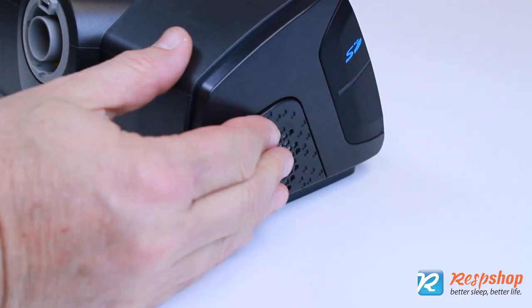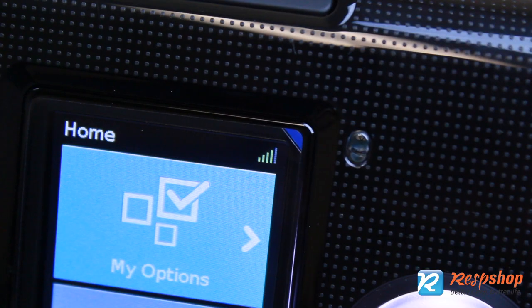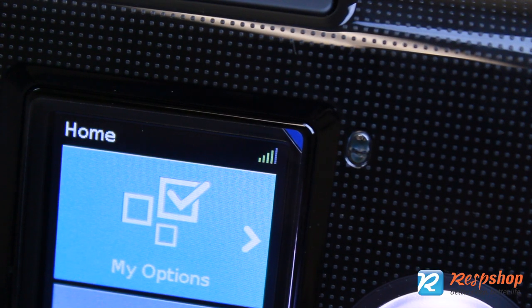The air filter compartment is situated at the rear edge. The left side compartment holds an SD card. Data transmits through the onboard cellular connection.